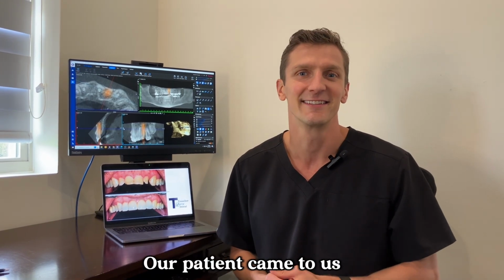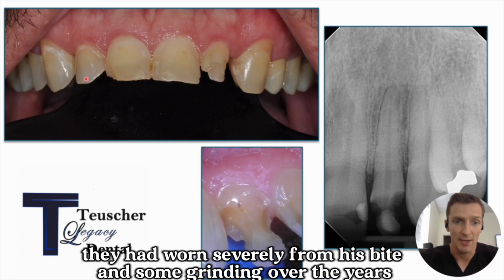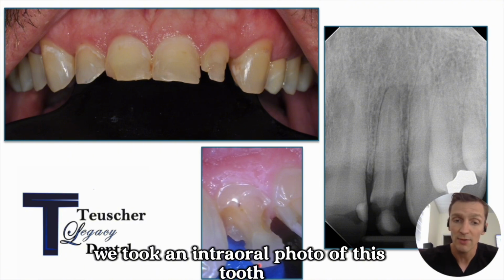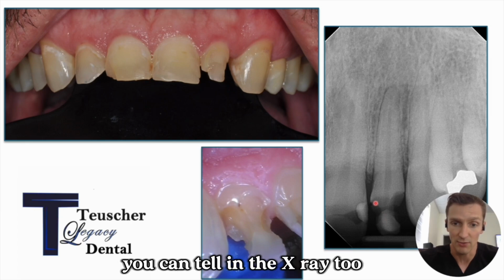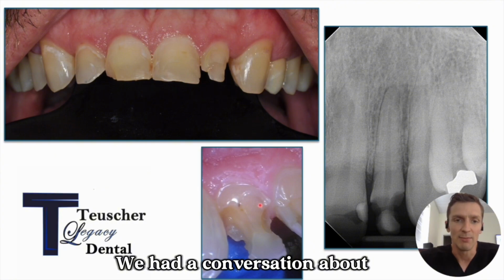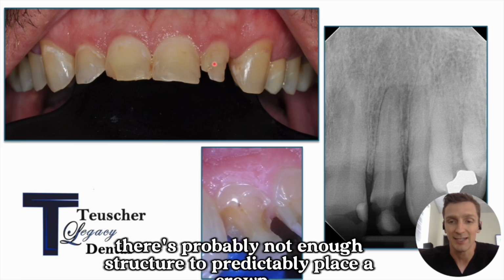Let's get started. Our patient came to us because he didn't like the look of his front four teeth. They had worn severely from his bite and some grinding over the years, this tooth in particular. Now you can see we took an intraoral photo of this tooth, and there's just not a lot of tooth structure left. You can tell in the x-ray too, very thin structure there. We had a conversation about these other three teeth would be suitable for crowns. This one, there's probably not enough structure to predictably place a crown long term.